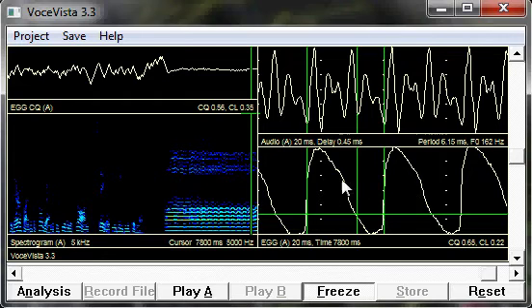If you do not see a stable signal in this window, you will need to adjust the placement of the electrodes against your larynx until you do. The EGG unit in the lab is capable of reading a signal from the vast majority of people, but if you have a large neck with significant fat between your skin and your larynx, you might not be able to get a usable signal. Also, some women have a broad thyroid cartilage that prevents clean signal acquisition. So if you are unable to get a good signal after repeated attempts, with the help of the lab assistant, you will need to compile the measures on a friend or another class member.